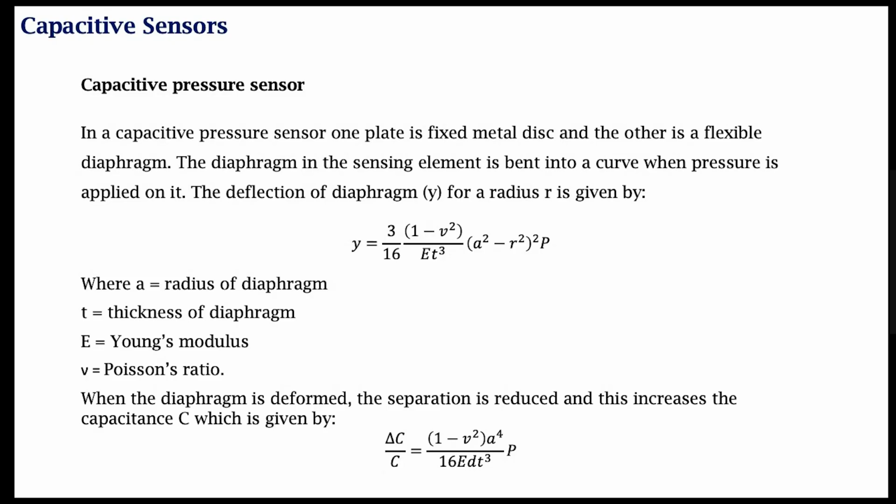So that deflection y is given by this equation. So when the diaphragm is deformed, the change in the capacitance from the original capacitance is given by this equation at the bottom of this slide. So now I can measure the change in the capacitance.